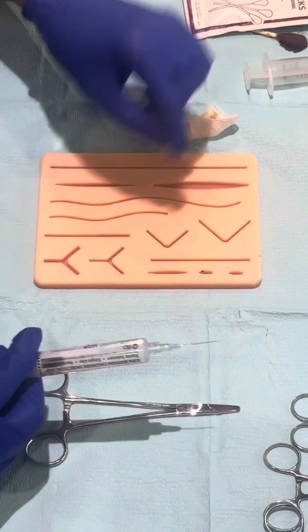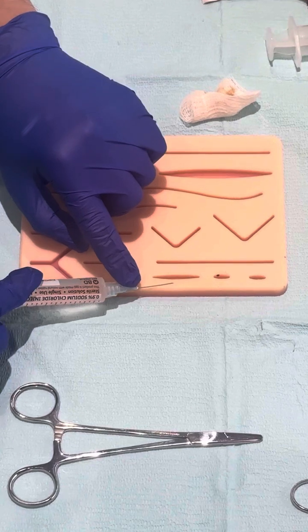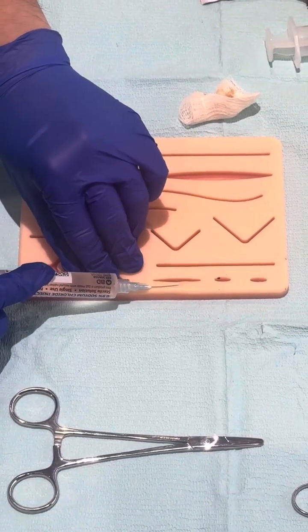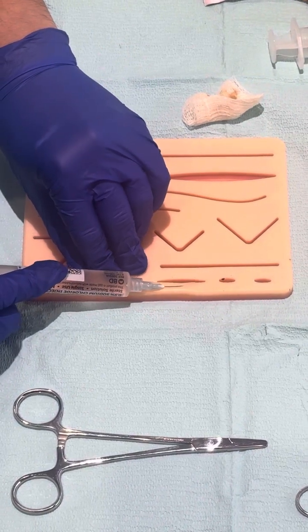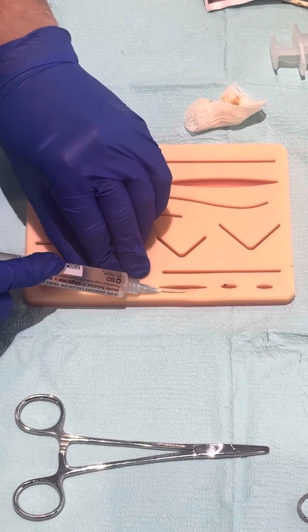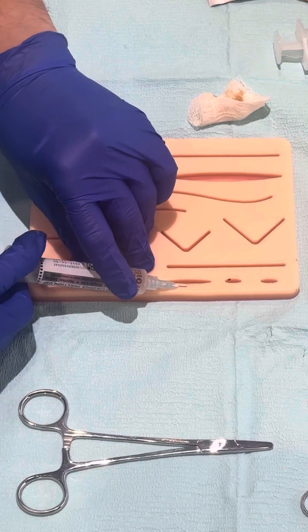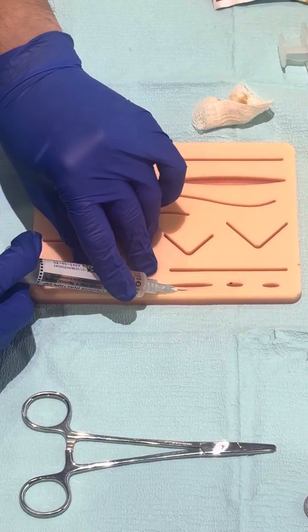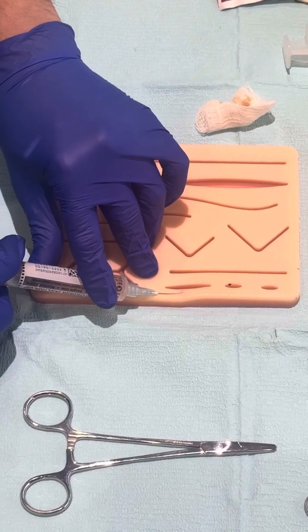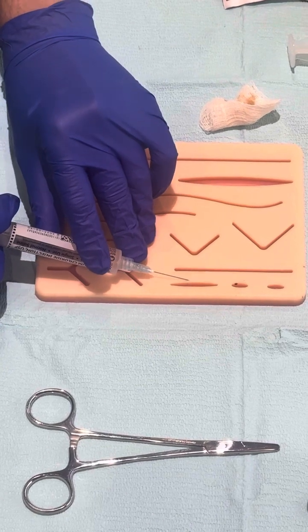Then you go to the other side, approximately until here, and insert the needle again towards the other end. As you withdraw, you inject the anesthesia. And then again on the other side.